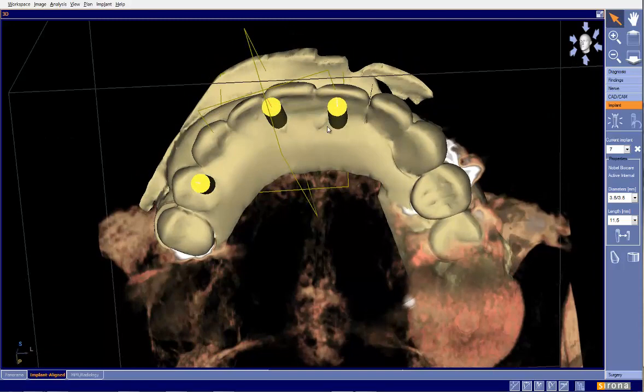One of the issues, and my preference is a locator abutment, just my personal preference, but one of the issues we have with locator abutments is they use O-rings and housings to snap onto the abutment, onto the locator itself. So when we have deviations of parallelism, then we have the risk of these O-rings not fitting, creating a path of draw issue, or the O-rings not working or lasting as long as we'd like them to be.